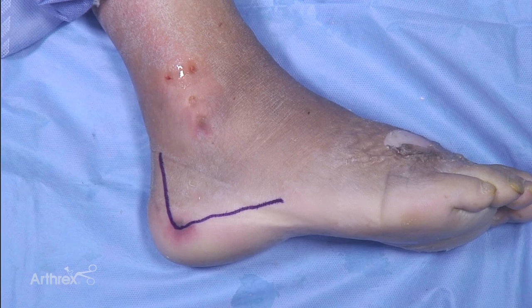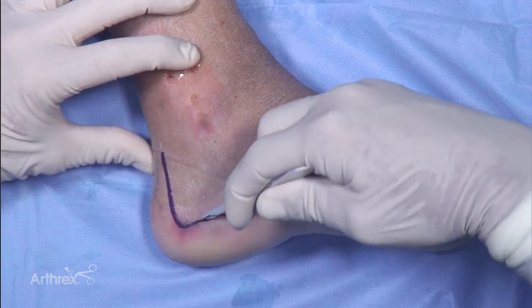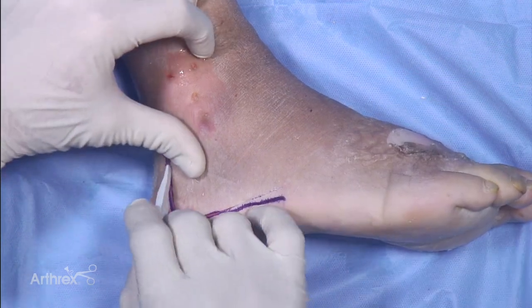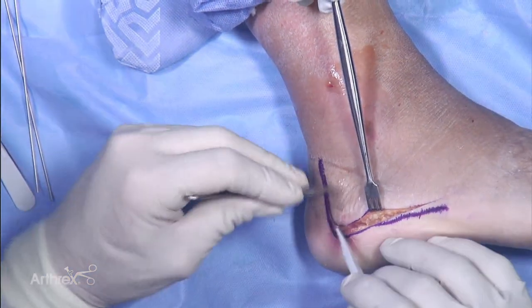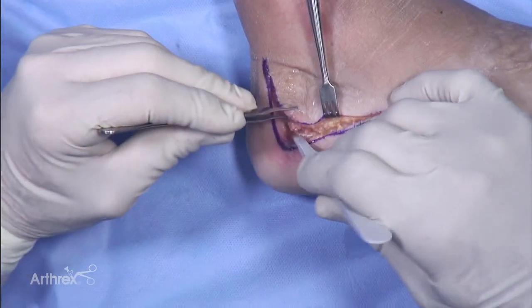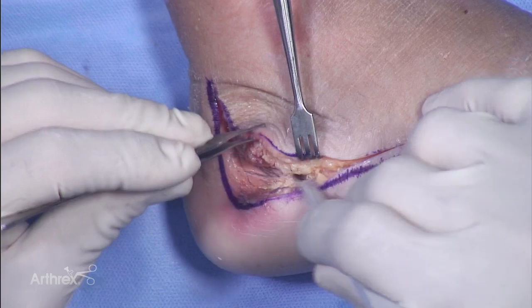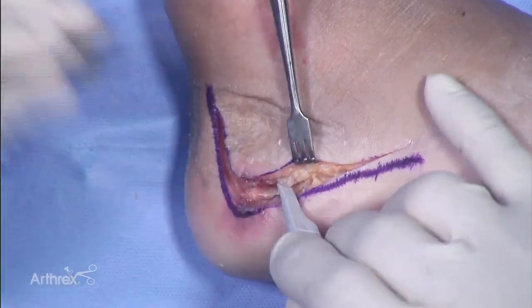We're going to make this a fairly extensile view for the demo. It's very important that full-thickness flaps are carried out in this approach — healing is an issue with these fractures. Back around the turn, you want to go full thickness right down to the bone and really lift this right off. The goal is to have the sural nerve and the peroneal tendons within that full-thickness soft tissue flap.